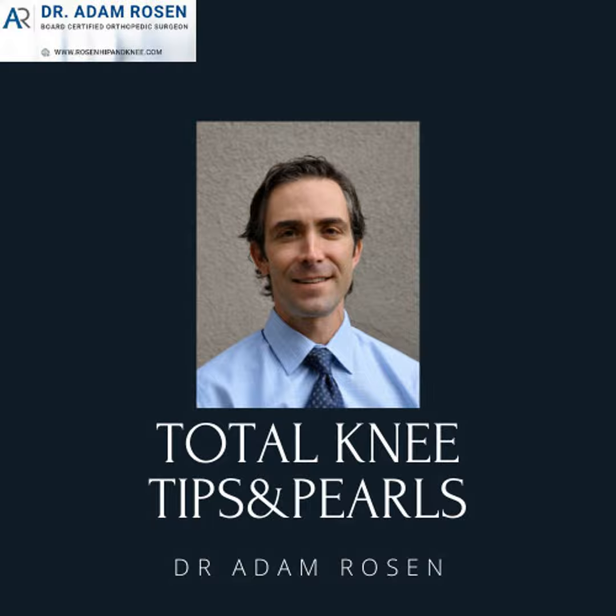Before I start to expose and remove the tibia, I take a look to see, is there anything that I can do again to improve my exposure? You may have to go a little further posterior medially. If it was a cruciate retaining design, you may have to release a little of the cruciate if it's still there. Sometimes even posterior capsular tension, just a couple millimeters off the back of the tibia, medially or laterally, allows that whole tibia to sublux forward. And then laterally, if there's a lot of soft tissue which has overgrown, you may put a retractor in there and remove some of that tissue.